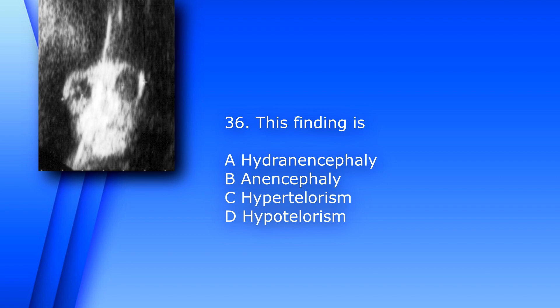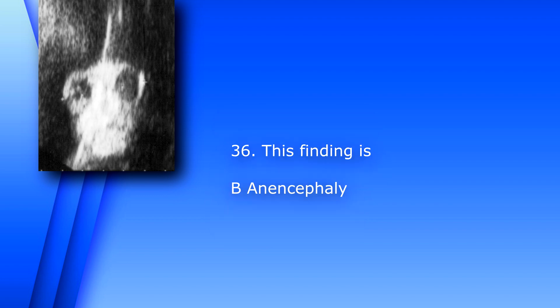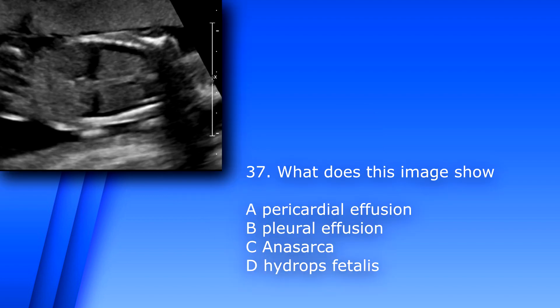Question 36: This finding is A) hydranencephaly, B) anencephaly, C) hypertelorism, or D) hypotelorism. You can see the typical frog appearance — there is no cranium and it is flat above the eyes. The answer is B, anencephaly.